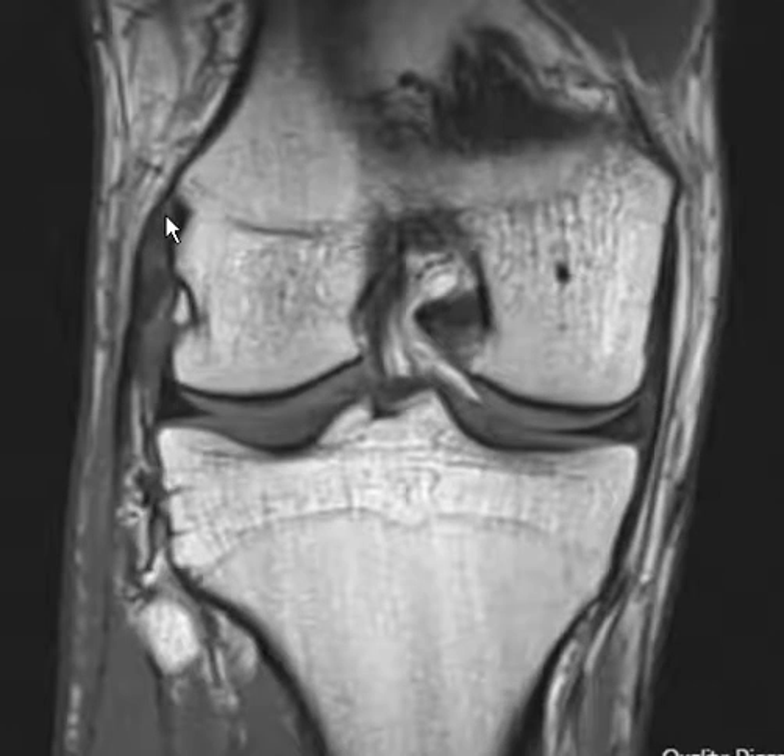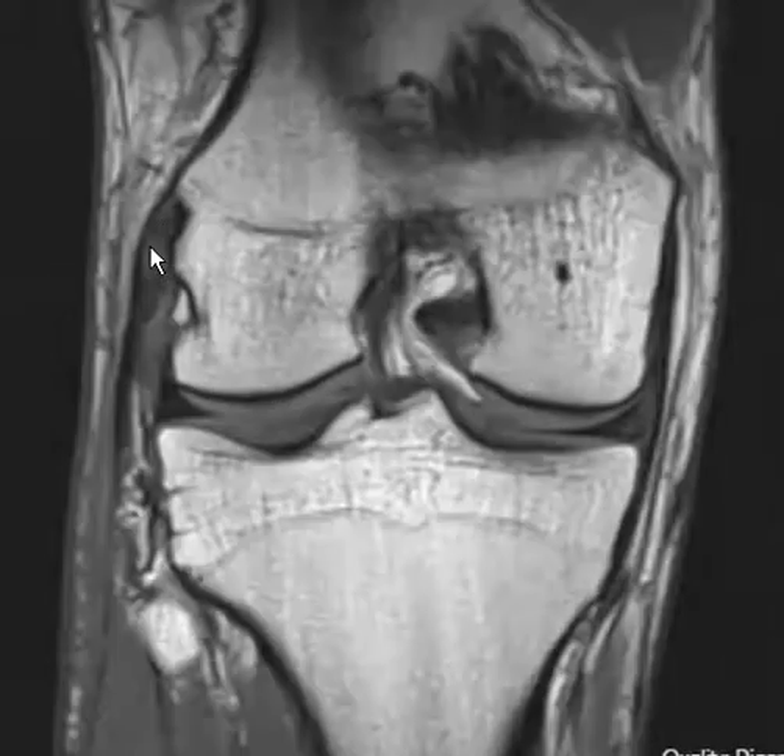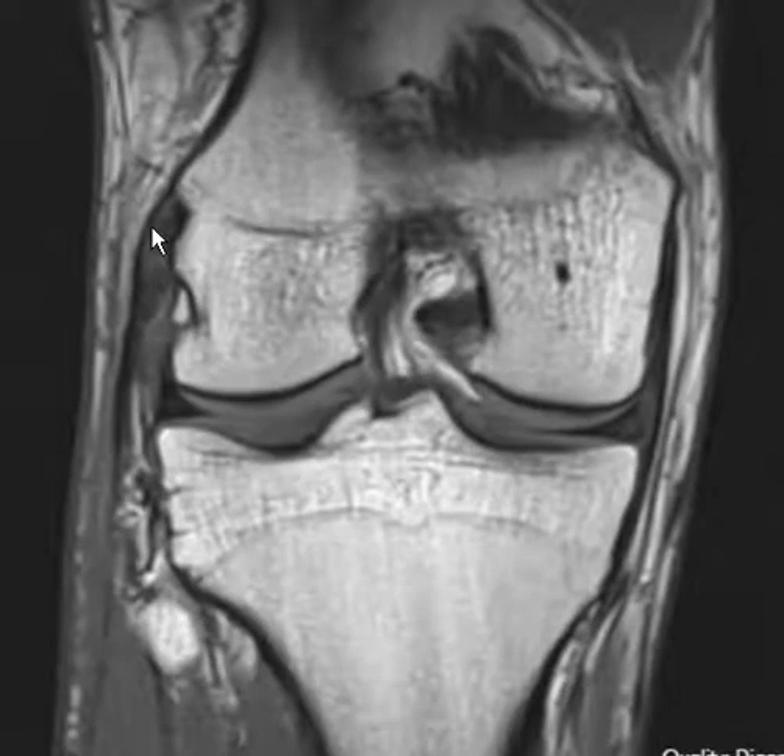This is the fibular collateral ligament, where it comes off the lateral femur. There's the tibia down here. We see the fibular collateral ligament looking a little gray here, so it's going to be a low-grade sprain. The central part, or mid-aspect, looks pretty normal.